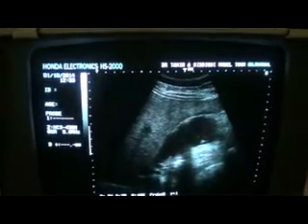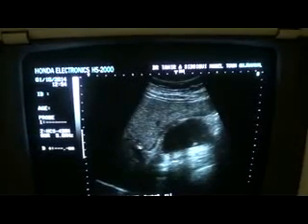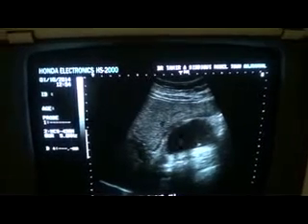Now this is the common bile duct — not dilated. No evidence of intrahepatic bile duct dilatation. Normal portal vein. This is the portal vein, which is at the right angle to the neck of the gallbladder.